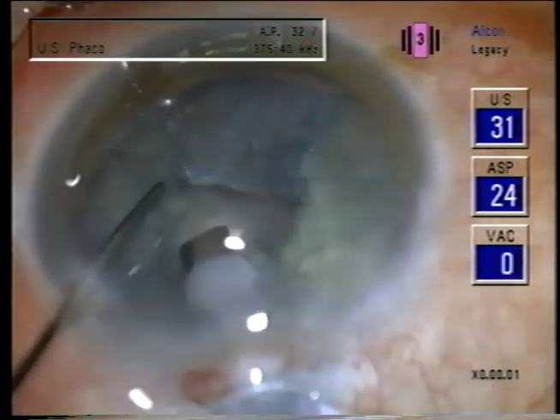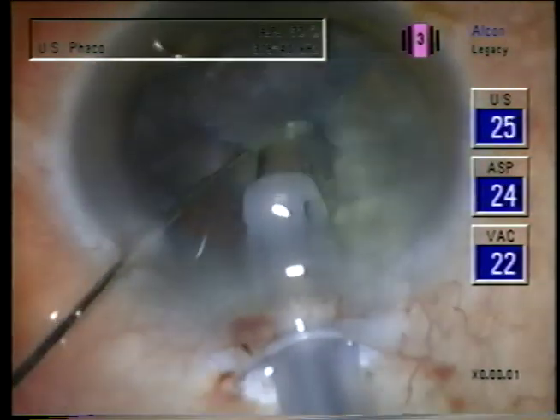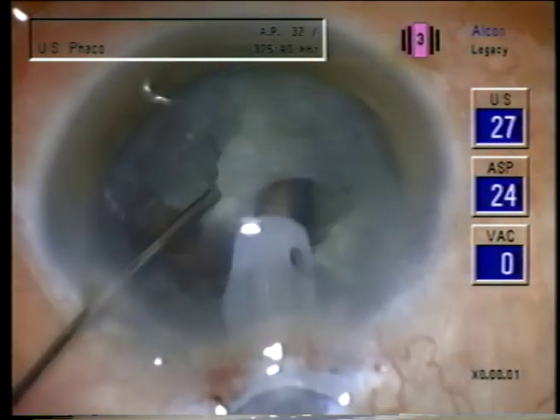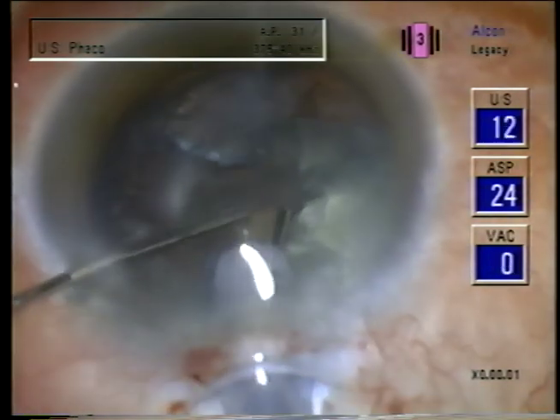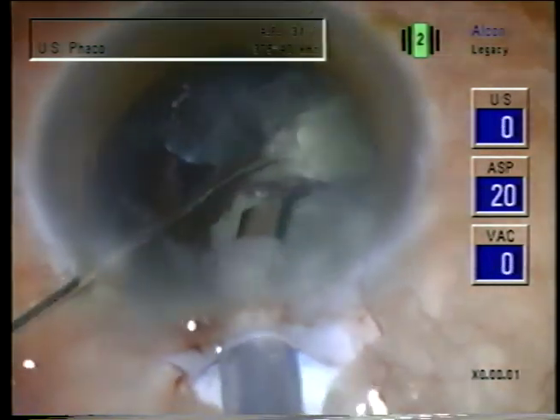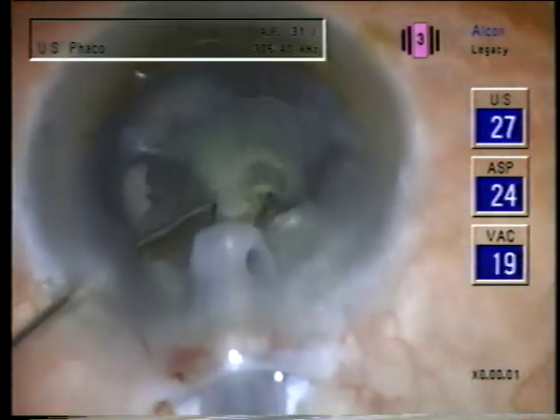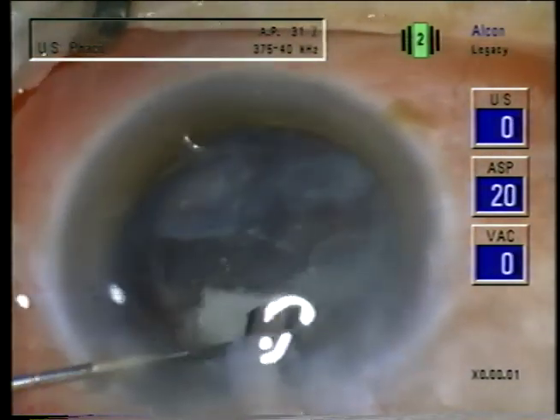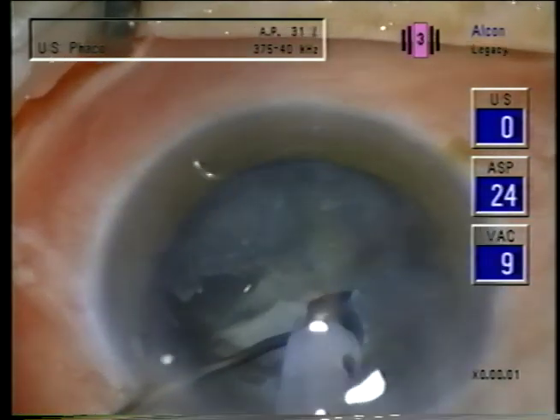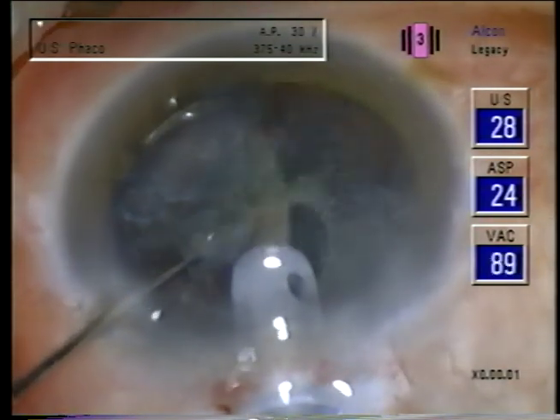Here I'm emulsifying as I fracture it. Now we'll go back and get those that were fractured but left in place. Notice the spatula can bring the material to the port — you don't have to go fishing with the phaco tip. It's a little more efficient to emulsify each segment as it's fractured.